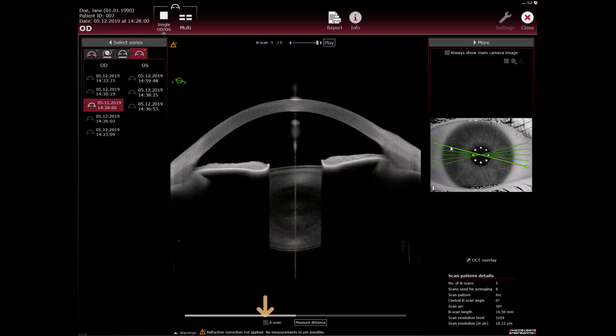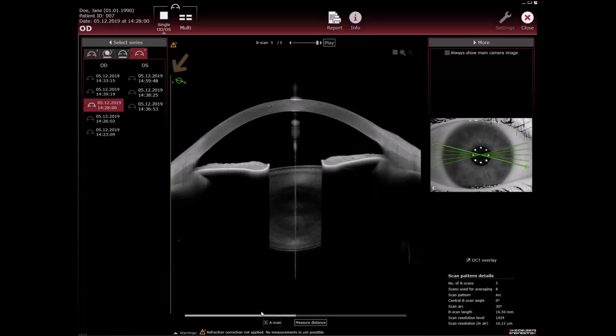When you select the A scan checkbox below the OCT section image, the A scan that corresponds to the position you clicked on the camera image is displayed.